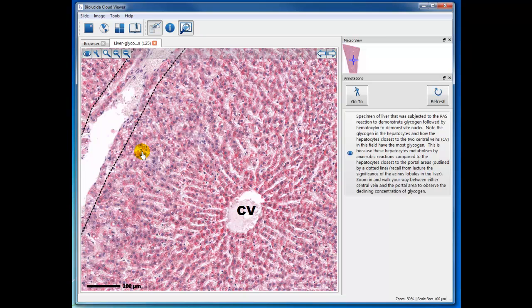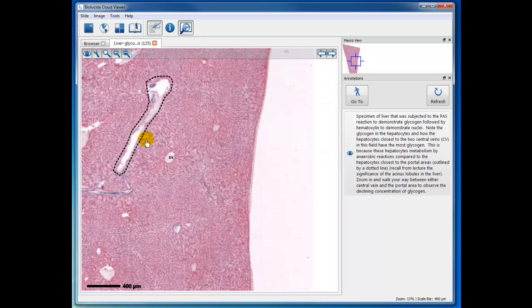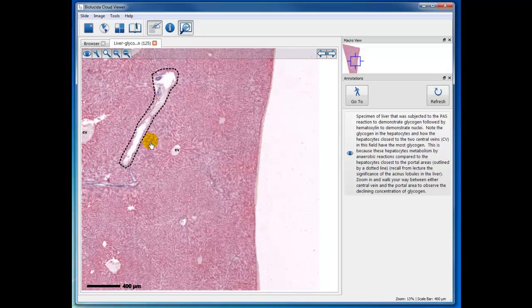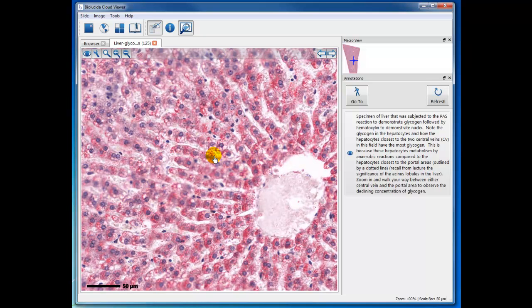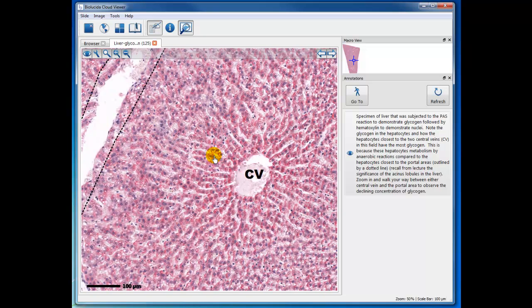arrangement of liver structure, as compared to the classic central vein with the portal areas surrounding the central vein, the zonal arrangement is reflecting the blood flow, the oxygenated blood that comes in from the hepatic artery and then flows across the sinusoids to the central vein, and by the time it gets about 1/2 to 2/3 of the way across, a lot of the oxygen has been extracted, and so these cells, the glycogen ones, are undergoing anaerobic metabolism, and that's why you have the glycogen.